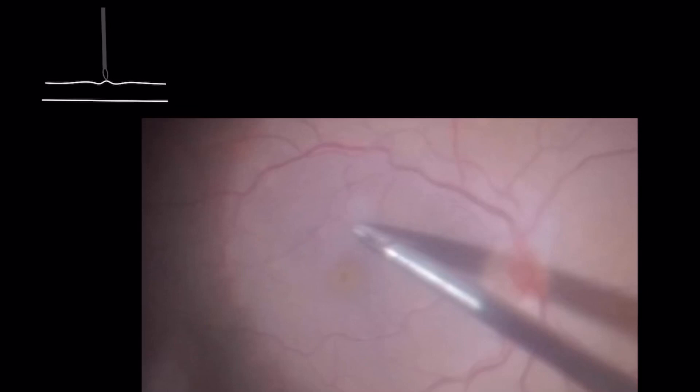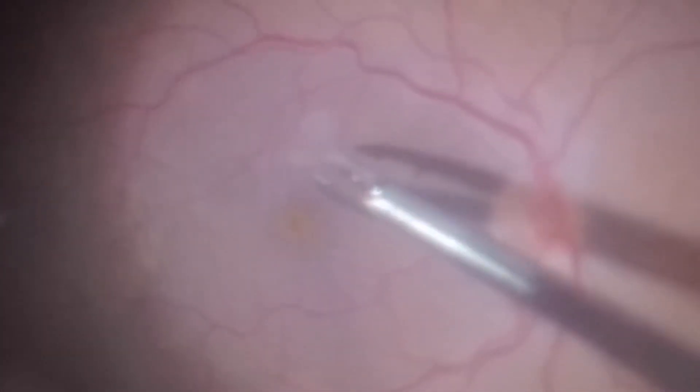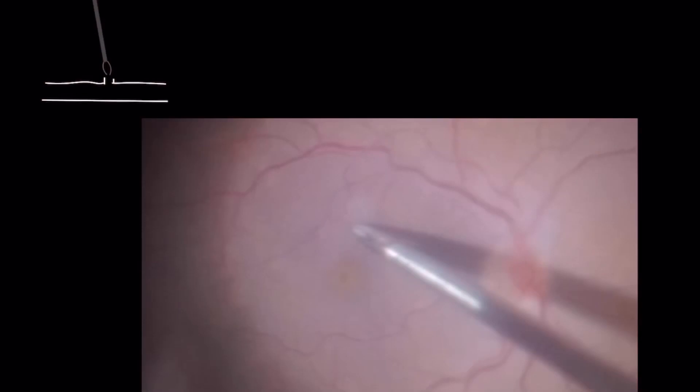To start peeling, pinch the ILM with the forceps, make a tine movement upward and then release it. This way you are able to separate the ILM from the underlying retina and to create an edge.